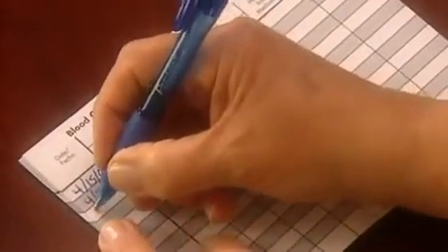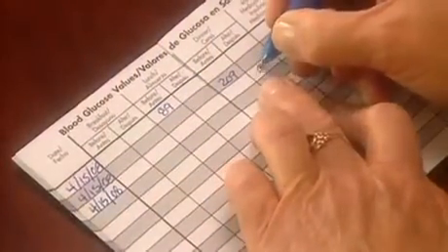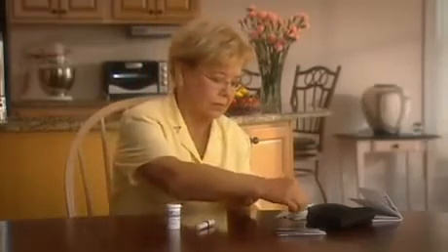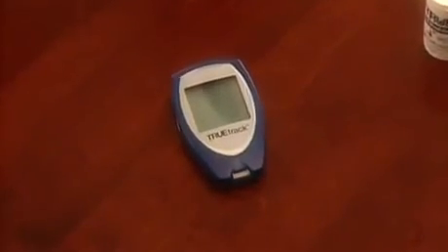Make sure to record this test result, date and time, in the logbook included with your TrueTrack meter. Once you've recorded the result, remove the test strip and discard. The meter will shut off automatically. The test result is then stored in the meter's memory for easy recall or to use for averaging of results.